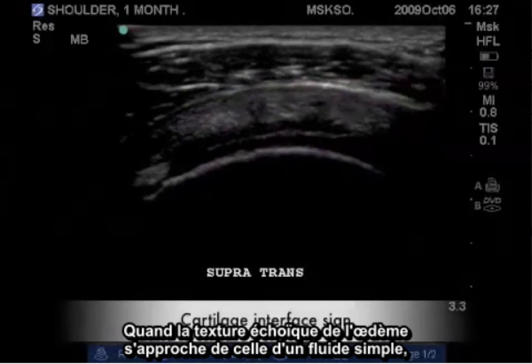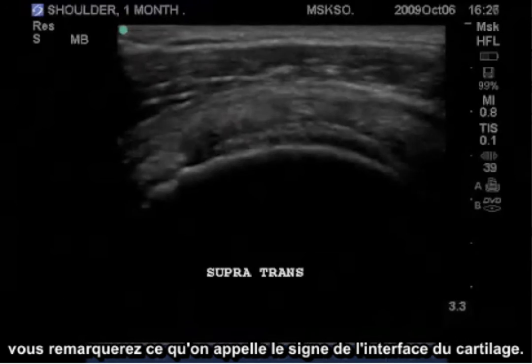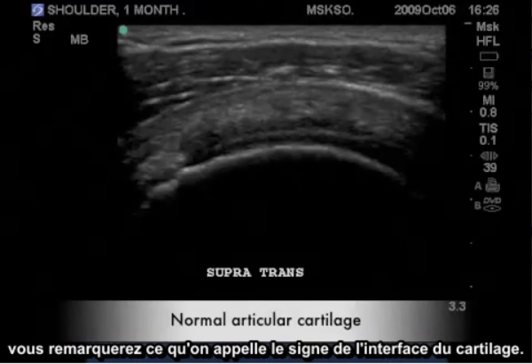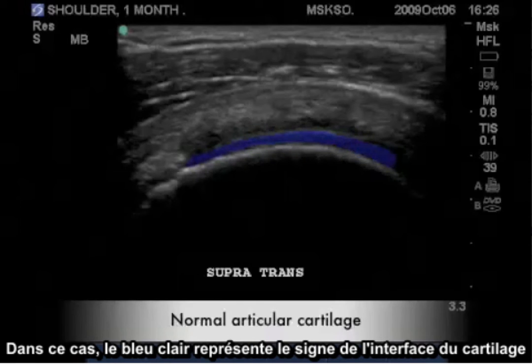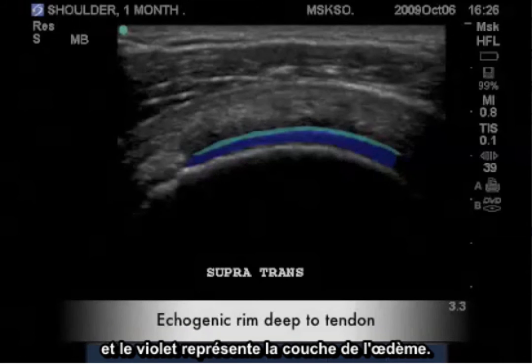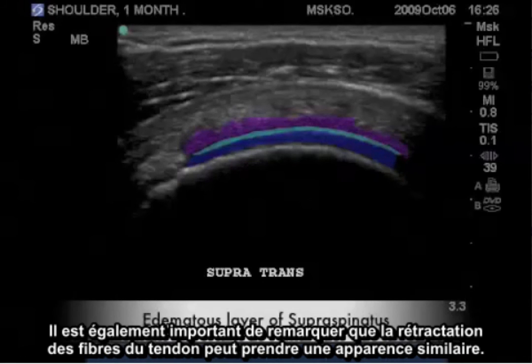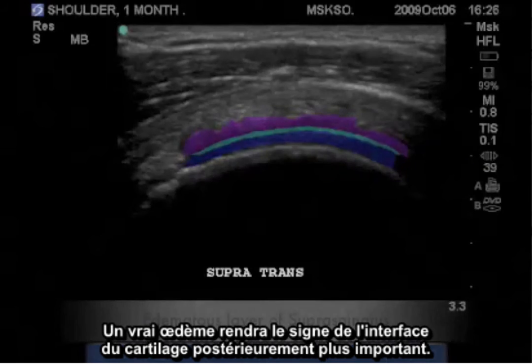When the echo texture of edema becomes closer to simple fluid, you will notice what is called a cartilage interface sign. Blue represents hyaline cartilage; the lighter blue represents the cartilage interface sign and the purple represents the layer of edema. It is also important to note that retraction of tendon fibers may also give a similar appearance. True edema will posteriorly enhance this cartilage interface sign.